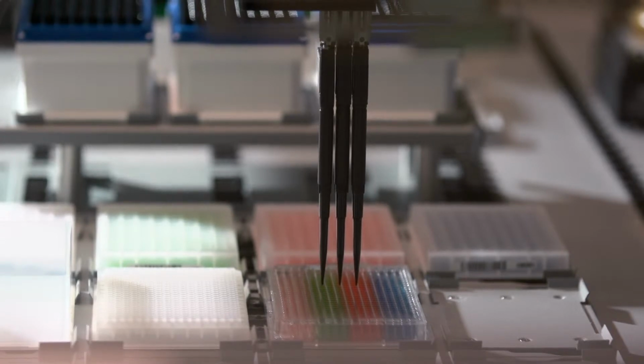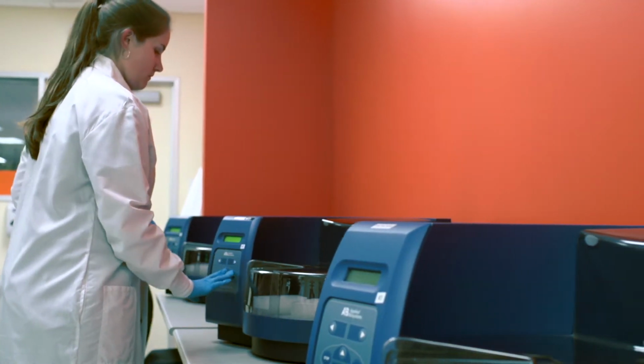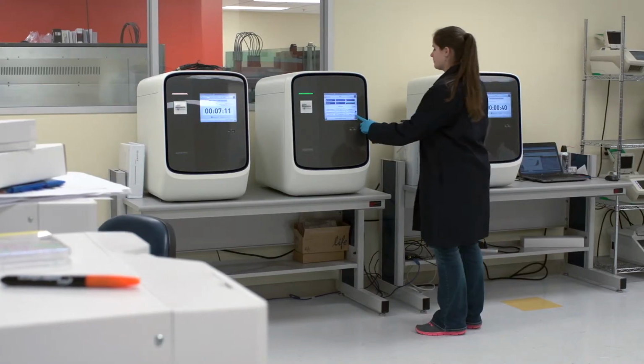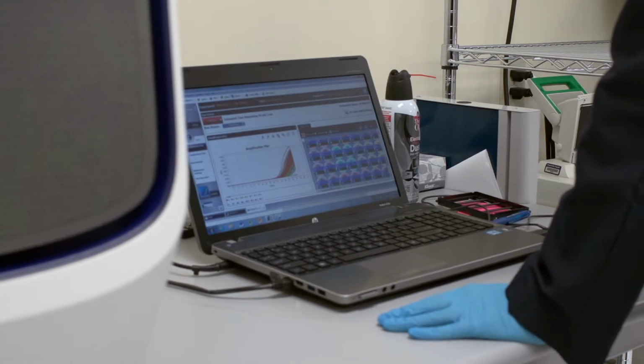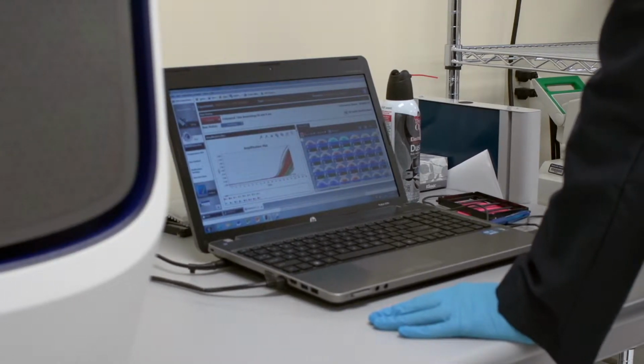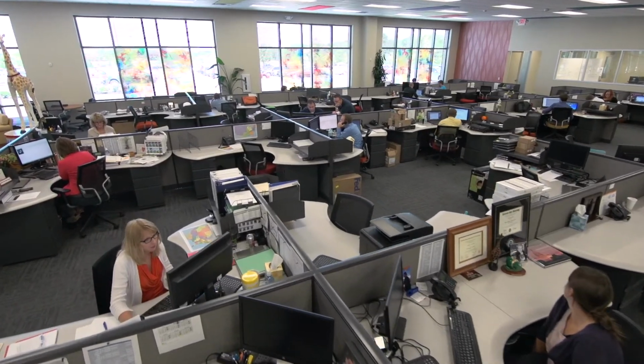AssureX Health uses the latest technology to analyze multiple genes from the cytochrome P450 family linked to a patient's metabolic capabilities for many psychiatric medications. In addition, AssureX Health analyzes a number of genes associated with medication response. We consolidate all of our findings into a report that is posted to a HIPAA-compliant secure web portal for you to access and download.